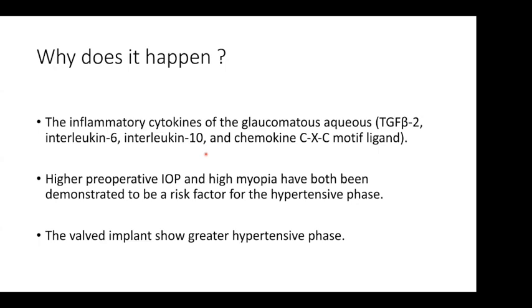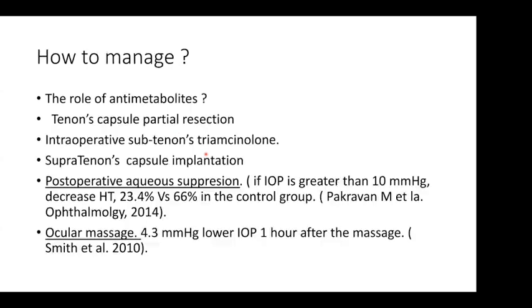Anyway, the valved implants have a greater tendency to have the hypertensive phase, but at the end of the day, there is no big difference between the valved and non-valved implants in pressure control. There might be some greater pressure reduction with the non-valved implants in the long term, but again, whether the difference is statistically significant or not, there are a lot of debates in this area as well.